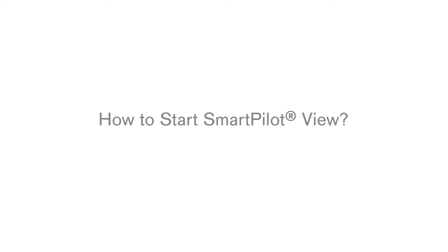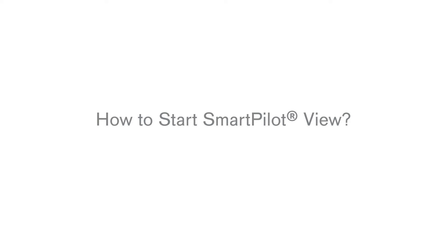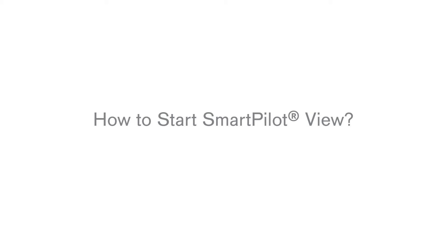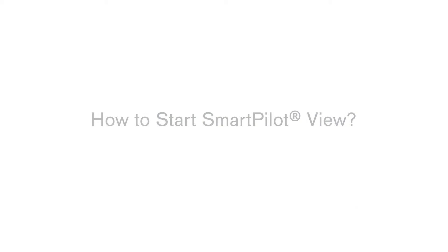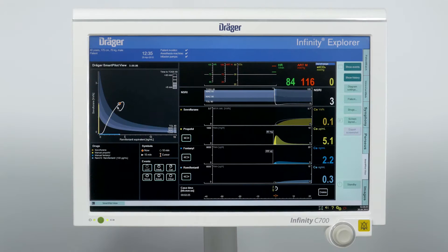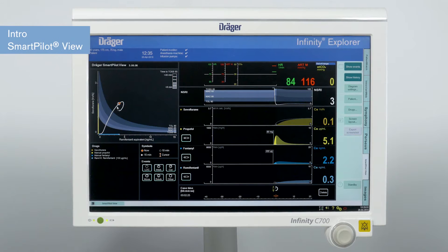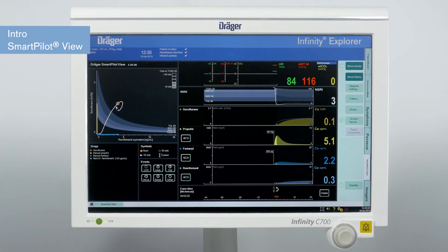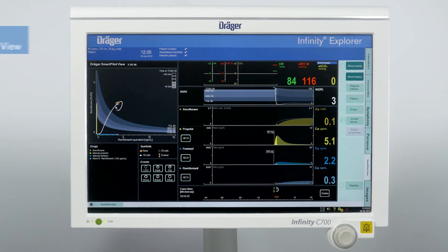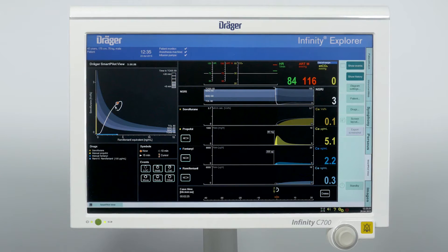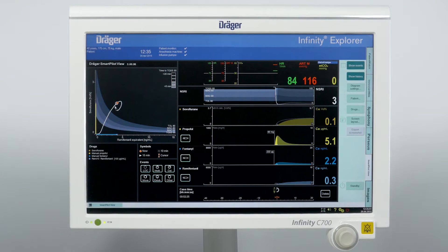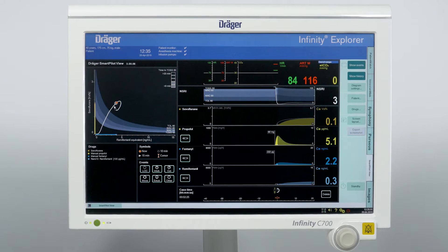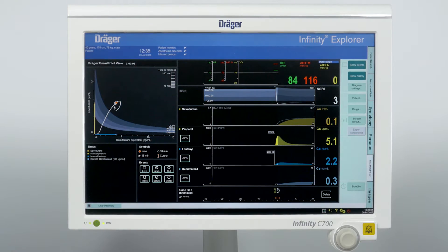In this episode, we will show you how to start SmartPilotView, check the connected devices, and work with the display. SmartPilotView is a software for visualizing the drug interaction during anesthesia with pharmacokinetic and pharmacodynamic models via an easy-to-understand display.